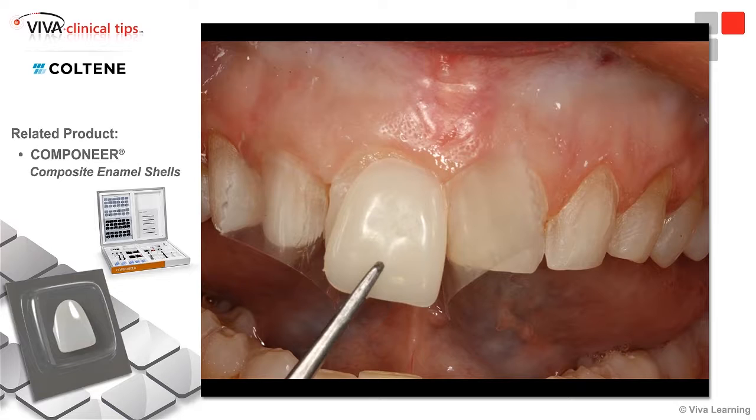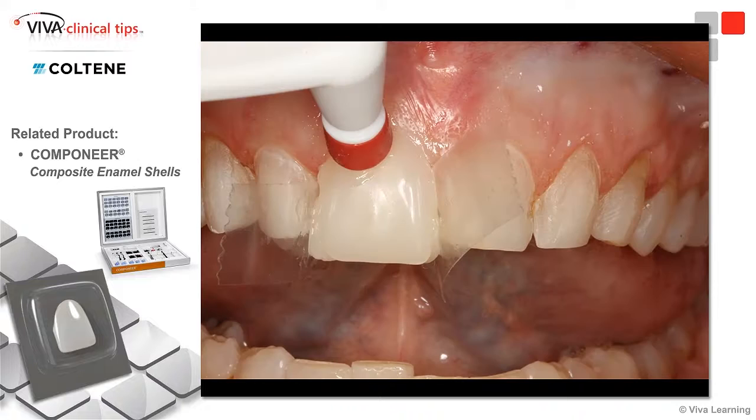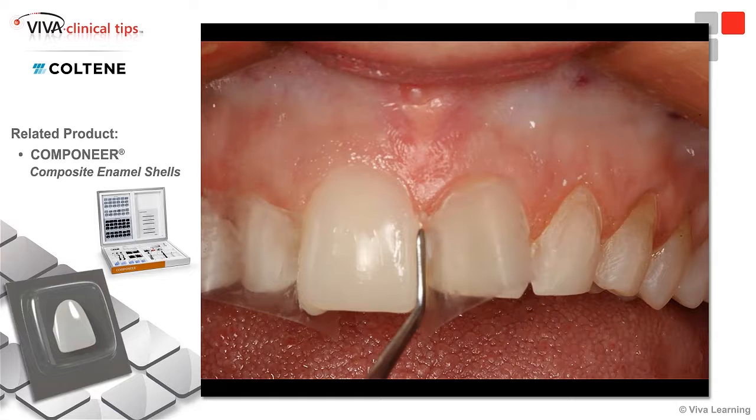And here I'm bringing the COMPONEER to place, and then you're using this instrument. It's called a placer, and it's just got a little silicone tip on it. But again, don't use this on porcelain, but you can actually press this COMPONEER to place. It'll extrude the excess material around the margins, the internal surface there. That's the Synergy D6, and then you just clean off the margins.